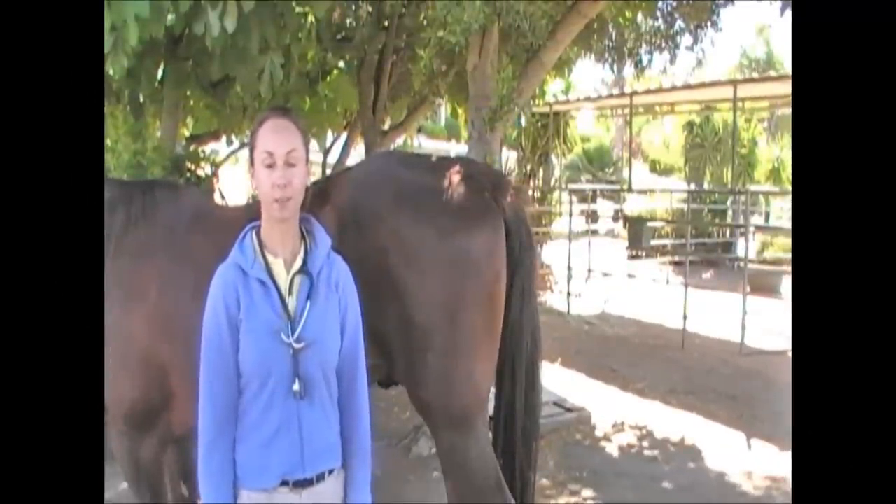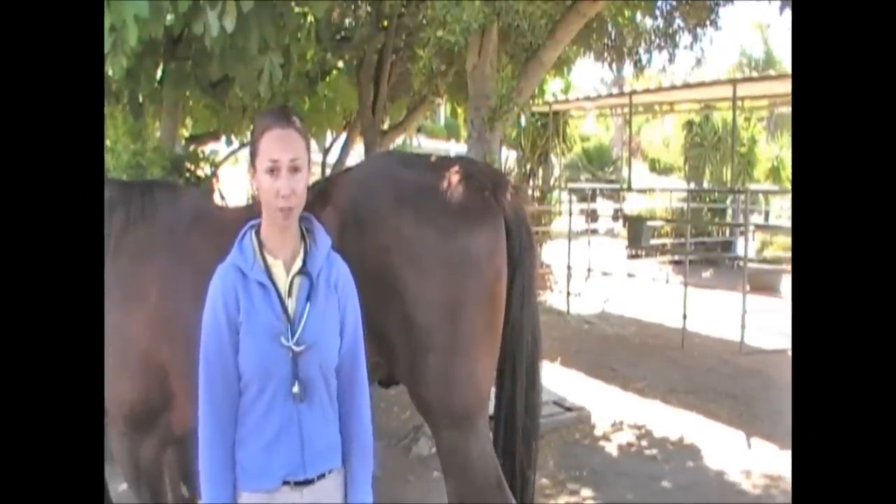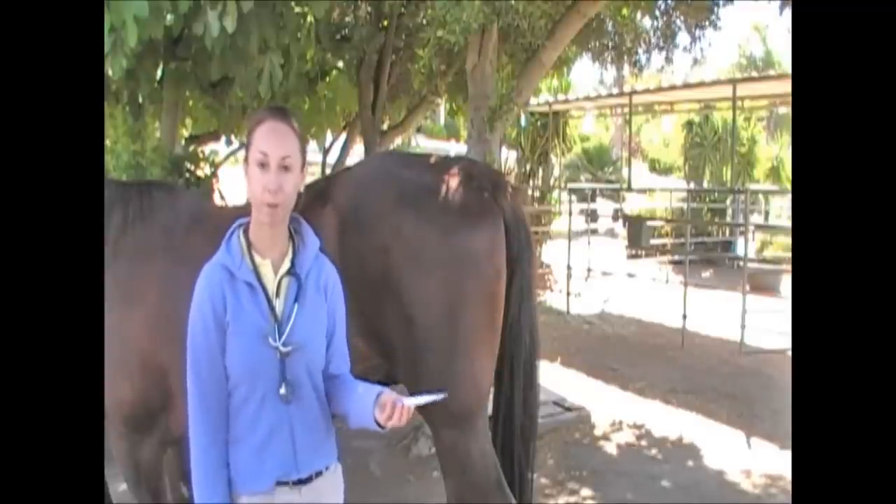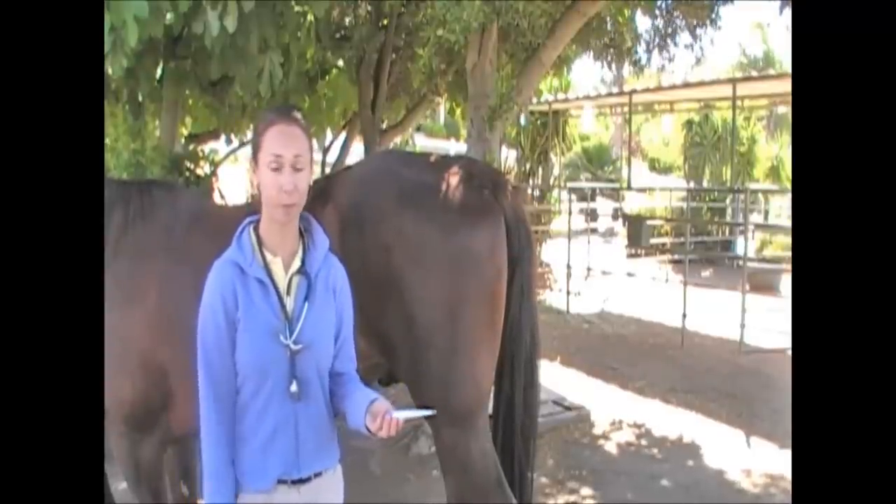The first part of the physical exam we're going to discuss is how to take your horse's temperature. We recommend getting an inexpensive digital rectal thermometer from your pharmacy. It does not have to be an animal-specific thermometer.